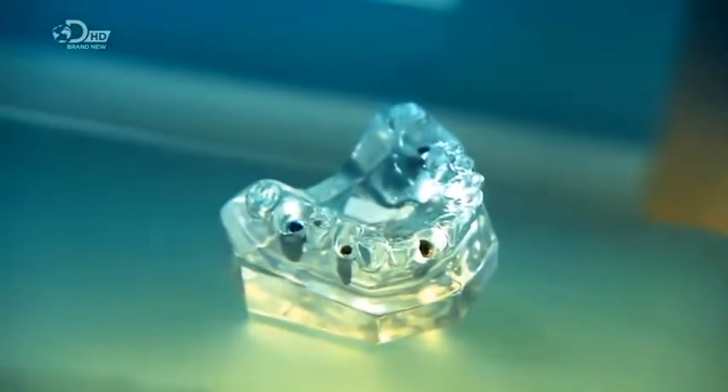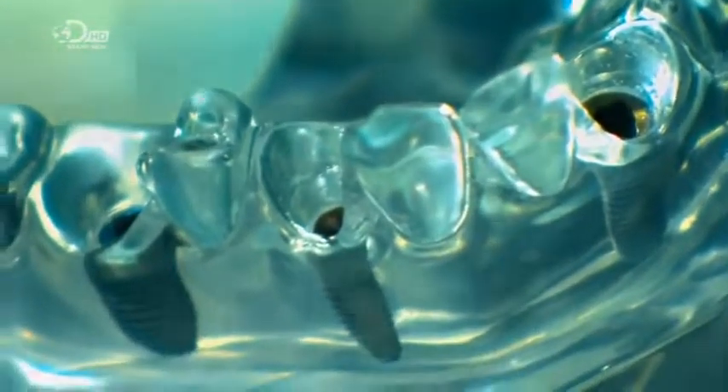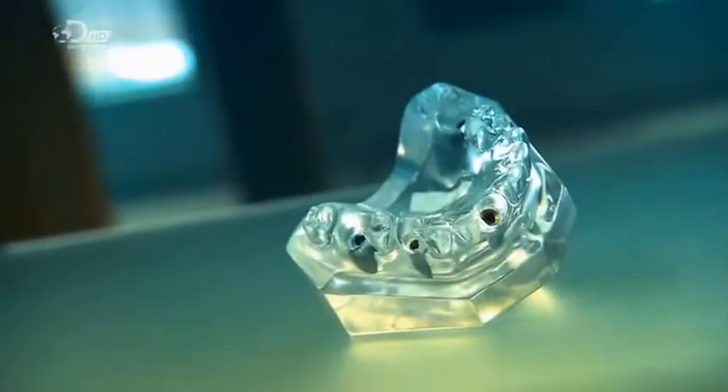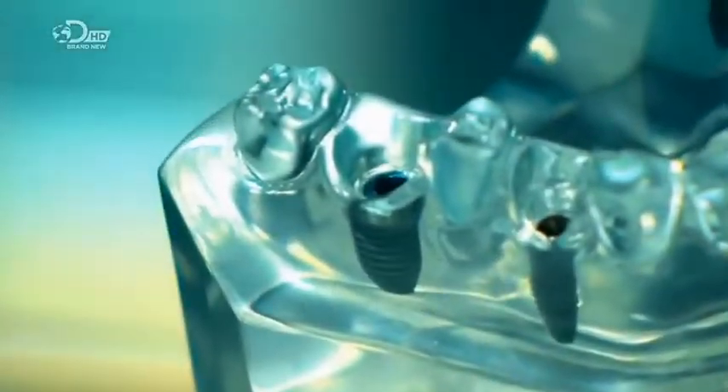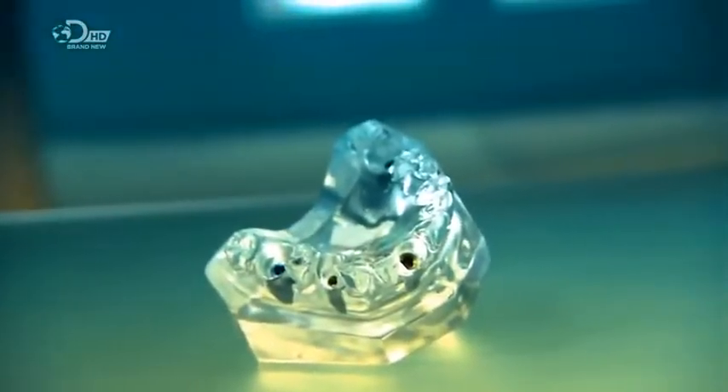The ancient Mayans hammered seashells into their jaws to replace missing teeth. That probably hurt. Those seashells were likely the first dental implants. Today, titanium tooth implants fill the gaps nicely — and of course, they're screwed in, not hammered.